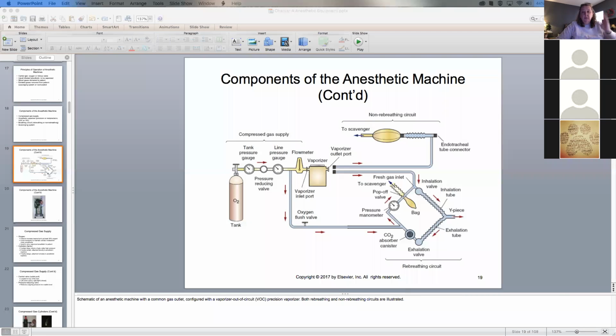I just uploaded the next thing that we would do if we had a whole week, which is anesthetic equipment, since we were just talking about inhalants. I uploaded it as chapter 4, anesthetic equipment, and I'm going to talk about just the vaporizer part. Then we will do the full anesthetic equipment in week 1 of anesthesia 2, so you'll have a little bit of it. But first I want to show this picture.